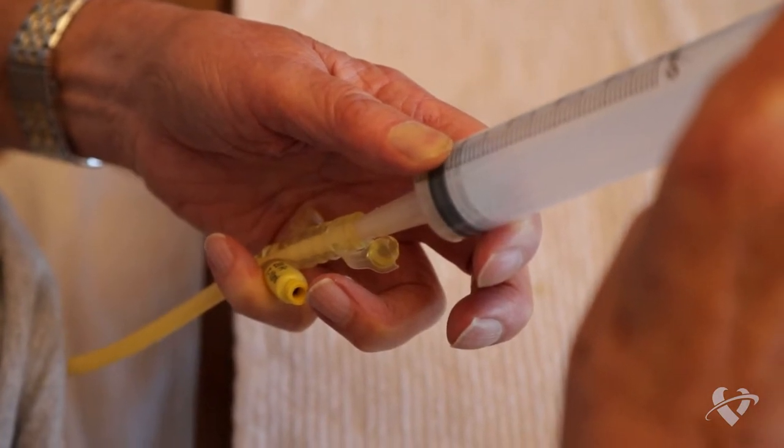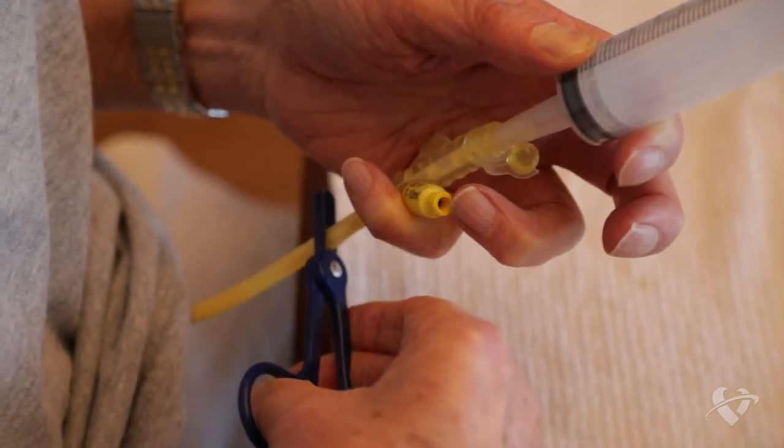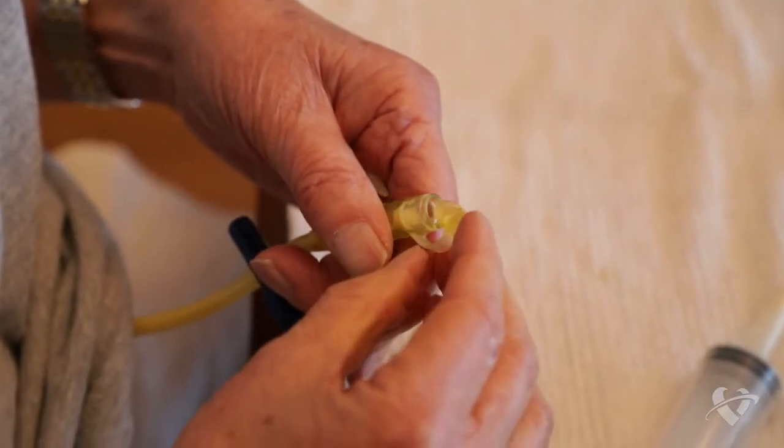Release the clamp or unpinch the g-tube before gently pressing the plunger to push the formula through. Once again, clamp or pinch your g-tube before removing the syringe and replace the cap. Repeat this process until you use all of your formula.